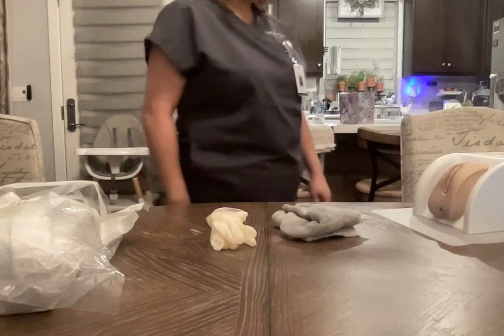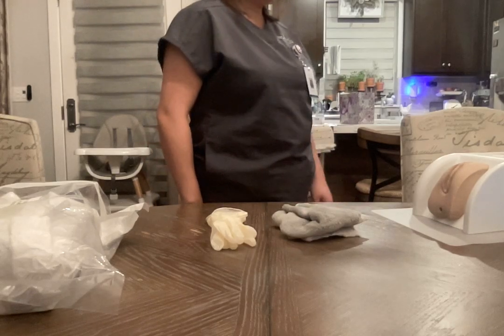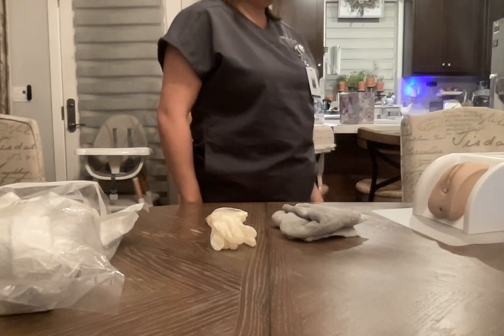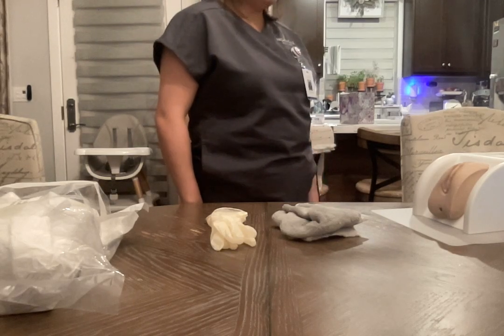Thank you. The doctor has ordered the placement of a Foley catheter, which is a tube that's going to sit in your bladder and continuously drain urine. Does that sound okay with you?